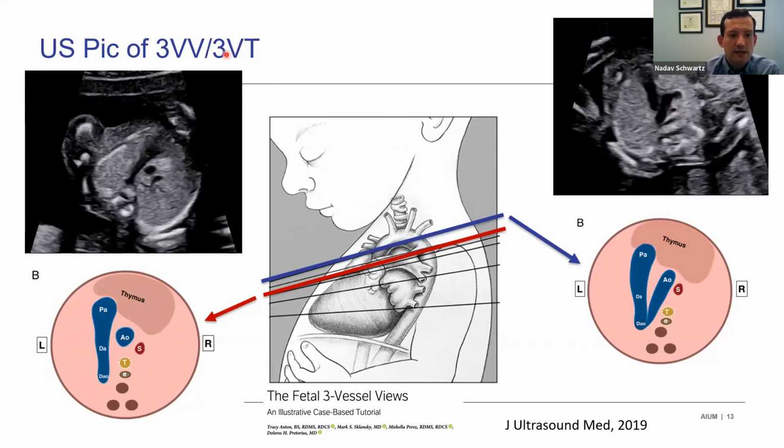So these are the two views. Again, the three-vessel view is more pivotal, but there's additional information you can get with the three-vessel trachea view that we'll continue to go through in this talk.